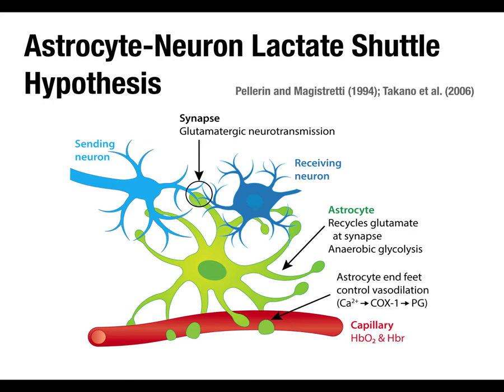So in principle, at least, there's stuff that could affect the fMRI signal that has no actual impact on changes in neural activity, but it's affecting something in between, in that pathway between the change in neural activity and the actual blood vessel dilation. And that's really important to understand because a lot of the time people don't fully appreciate that. And it has some impact on how you interpret fMRI data and some of the analysis approaches I'll talk about next class.